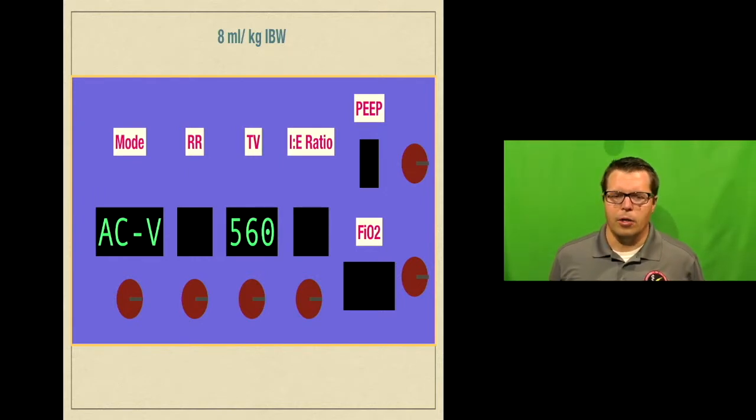And again, your tidal volume is going to be set based on the ideal body weight of the person. It's probably going to run for most Americans somewhere between 400 and 500, maybe 500 to 600 in an exceptionally large person, or in a significantly larger person anyway. If you're outside the 400 to 600 range, then you really need to go back and check your math again and make sure that you're doing this right, because most people are, again, going to fall somewhere in there, just as humans.